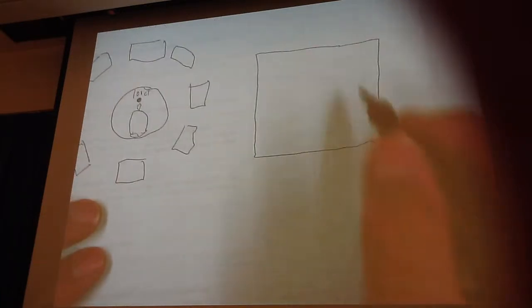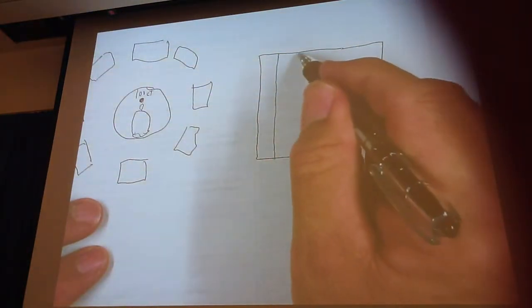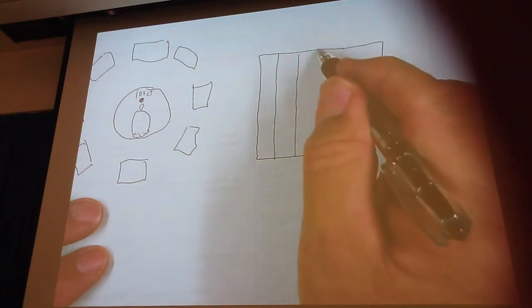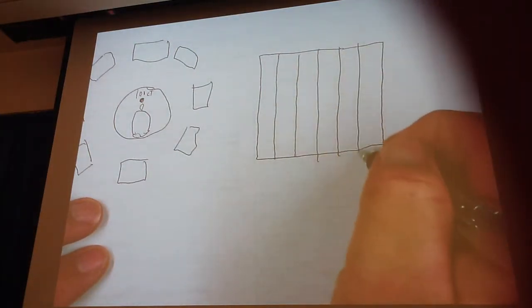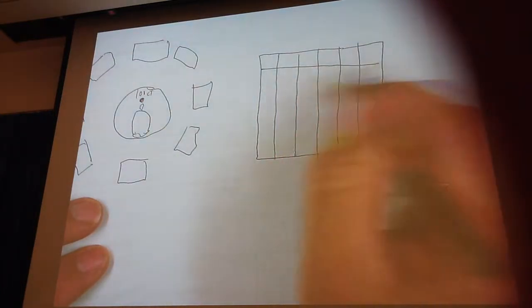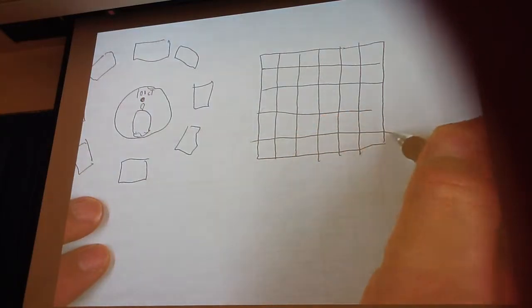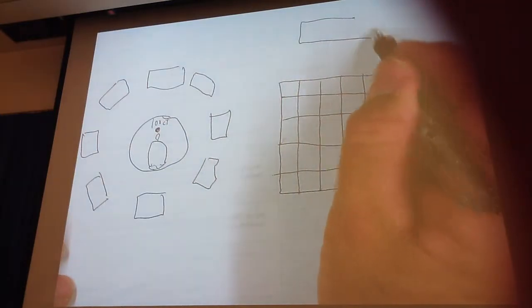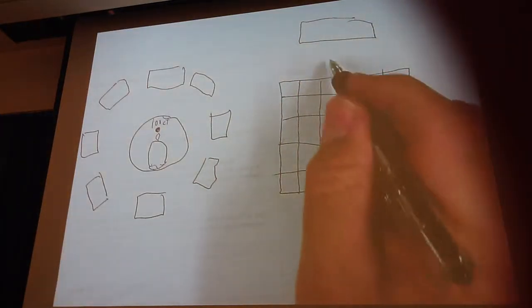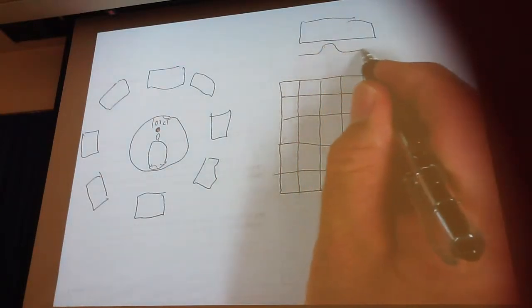But we want to talk about back projection here for a minute, because of some of the different computer processing we're going to be discussing. When the detector is over the patient and it detects 100 counts, it's going to create a signal that looks something like this.